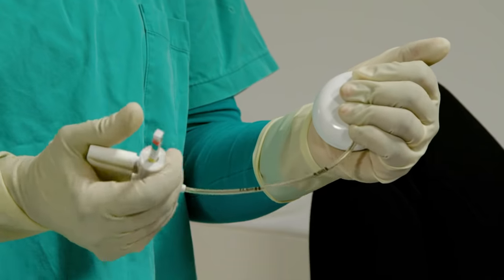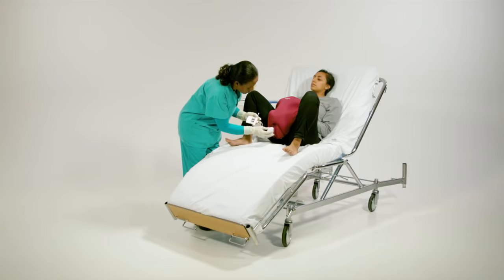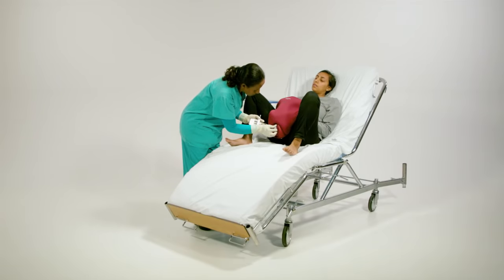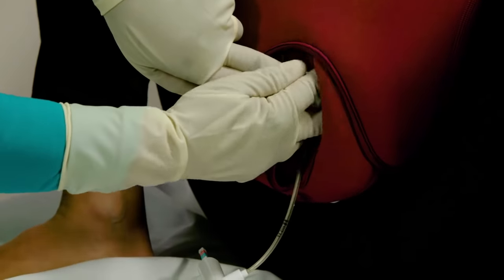Ensure your suction device is working properly. Apply the vacuum cup three centimetres from the posterior fontanelle and check that no tissue has been caught by the suction device.